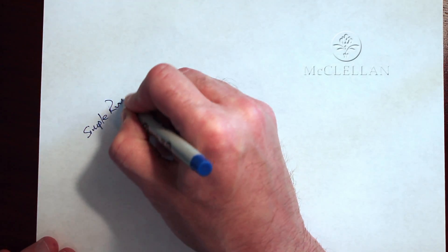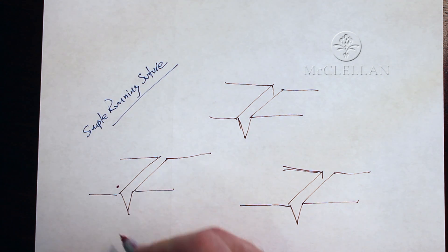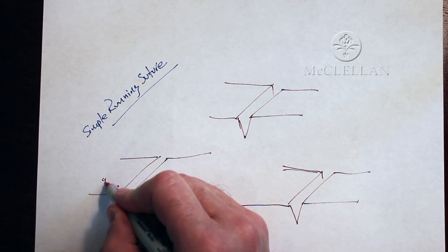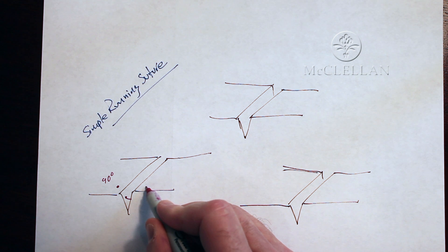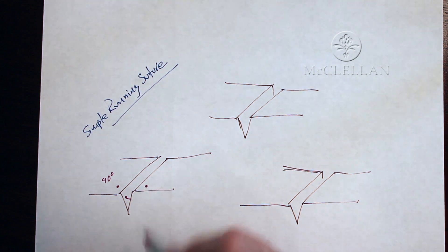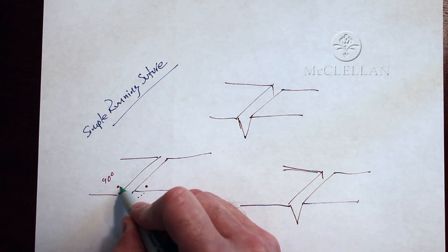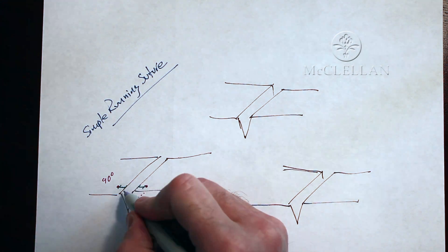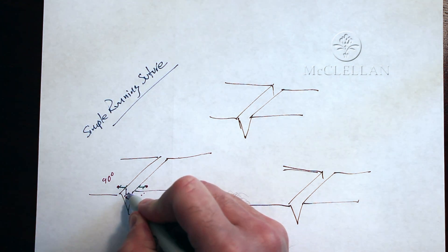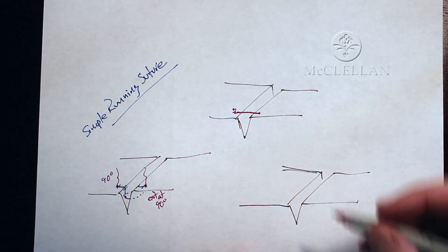I'm going to be talking to you today about the simple running suture. You're going to enter the skin at 90 degrees on one side, traverse through, come out at a certain depth through the dermis around to the other side, and basically directly across the wound at the same depth. The important distances are the distance from the skin edge to your entry and exit points, and remember to exit at 90 degrees as well.